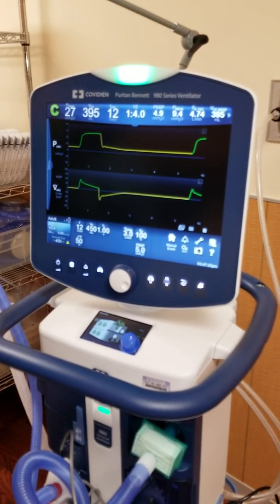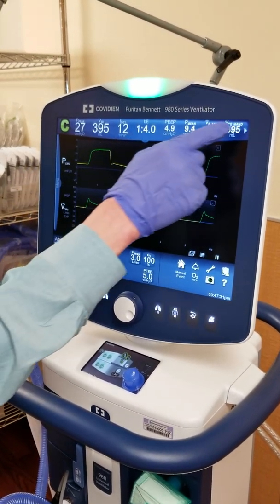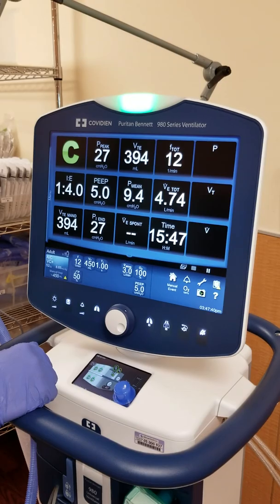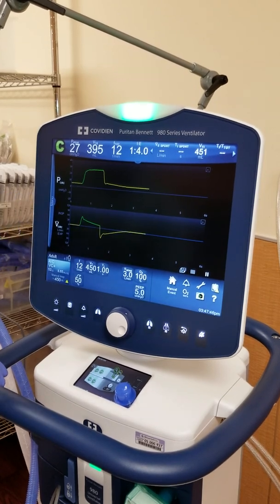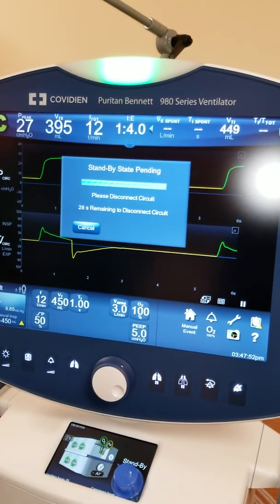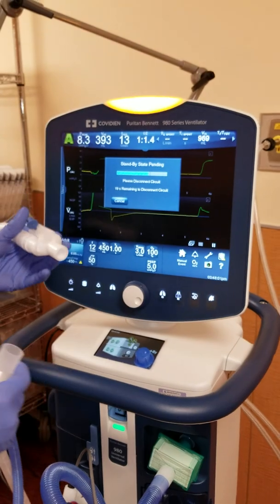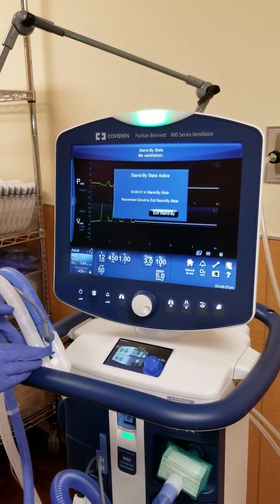Another thing, some of you feel comfortable about putting this machine in standby. I want to show you how to do that. Everything is on a slide. It's pretty cool. You can get to all kinds of measured parameters. You can tap some of these things twice. It can go into big numbers. And then if you go over here for standby, tap menu, and there it is, standby. And what it's going to say is, I'm not going to go into standby until I can tell that there's someone not on the other end. So as soon as you disconnect them, you hit confirm, and this is in standby.